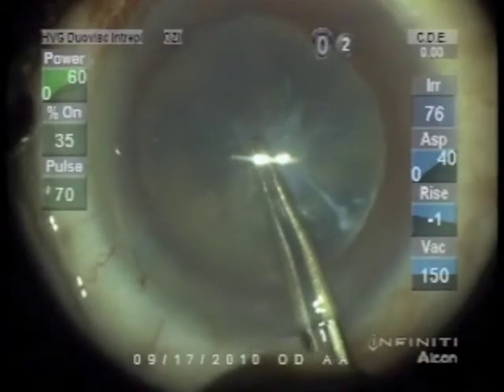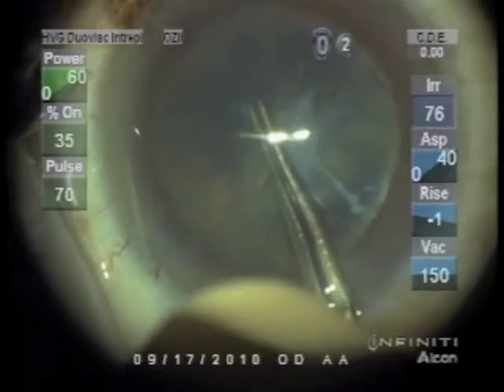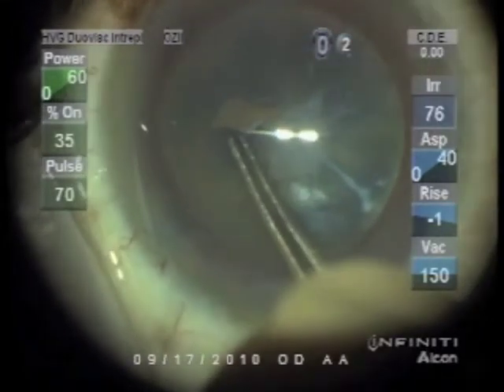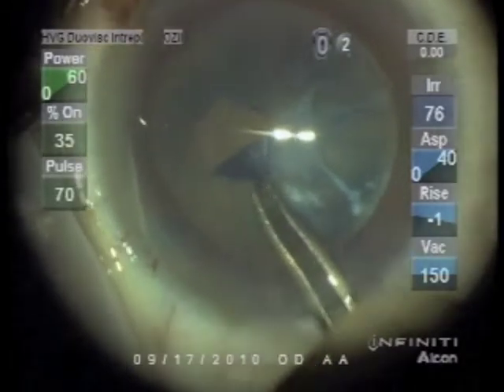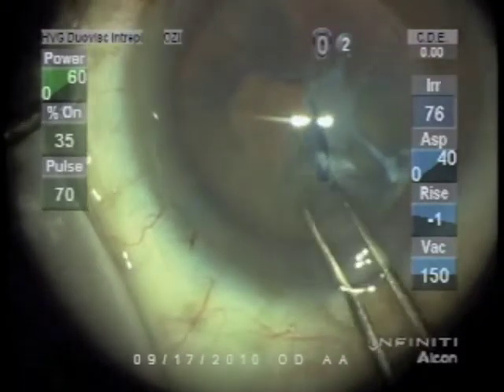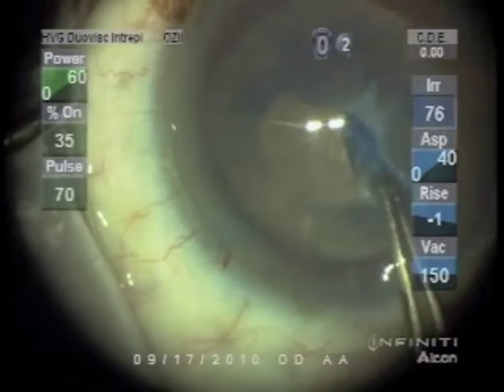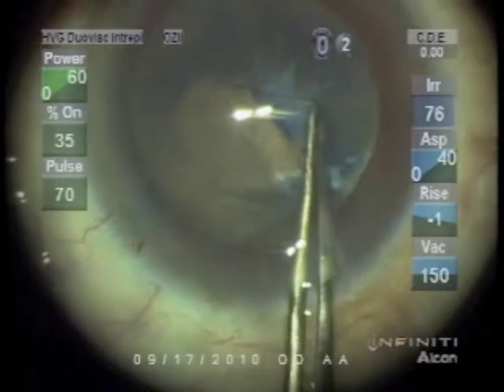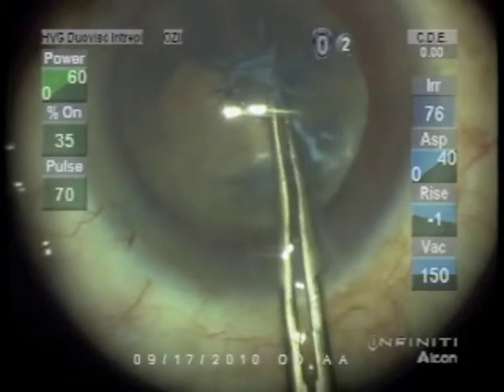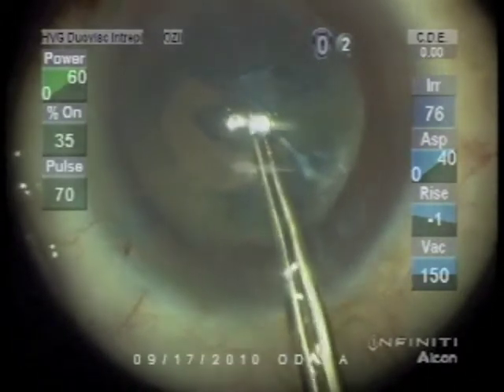Sometimes the anterior capsule has fibrotic elements that cannot be torn through, requiring either a fugal blade or cutting with scissors. We're reaching this strand of fibrosis on the anterior capsule, wondering whether we'll be able to tear through it or not. Fortunately, it's in a position where it will be easy to cut with scissors if we can't tear through it, but it's pretty fibrotic and I don't want to risk putting too much force there.